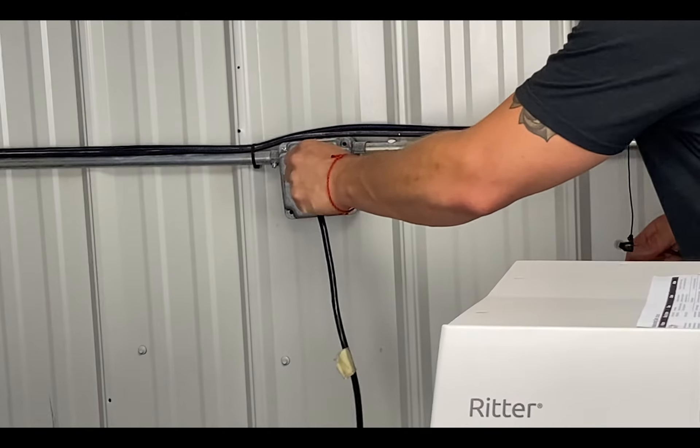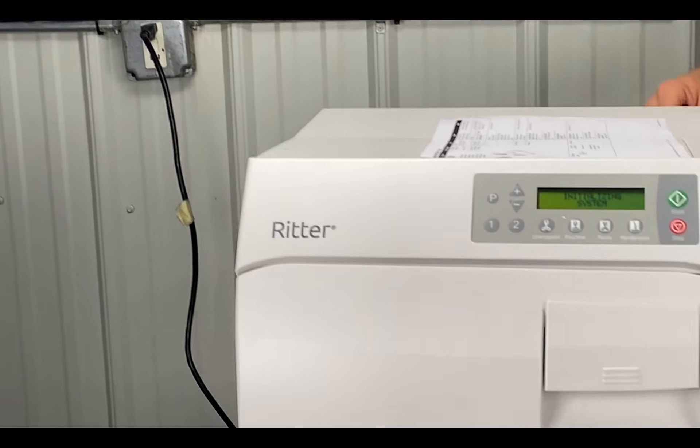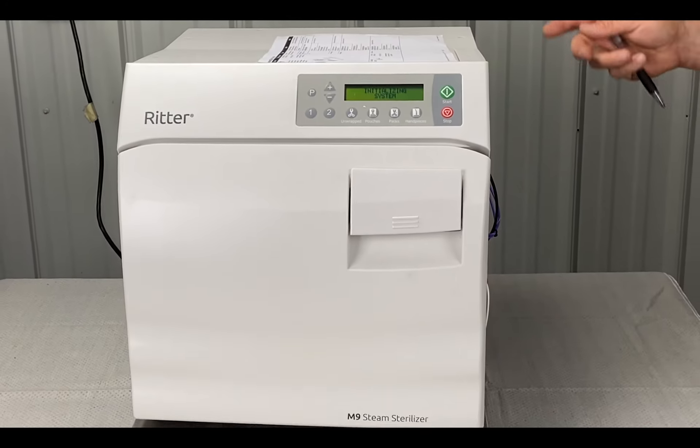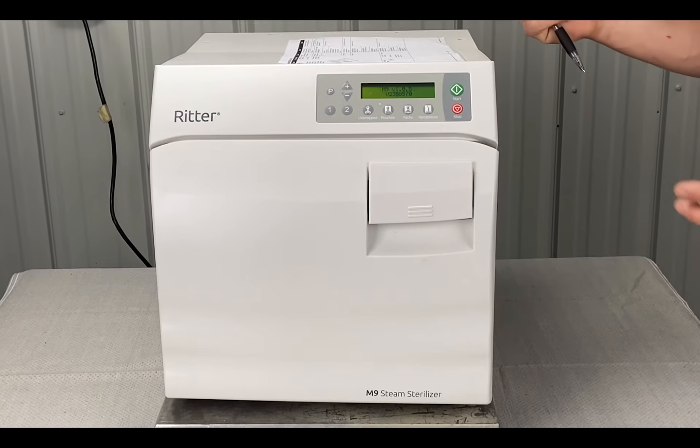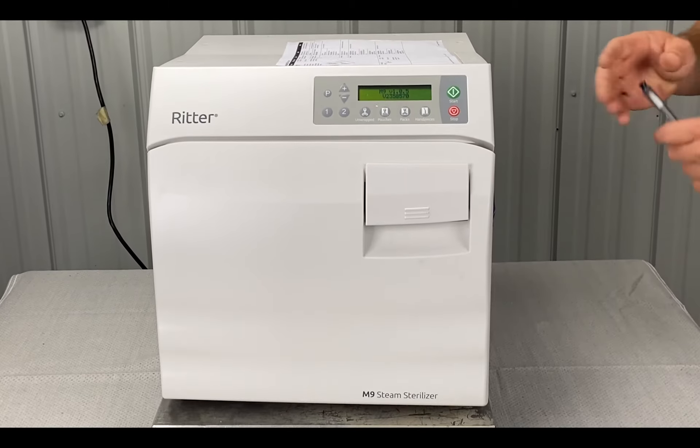Then you're going to plug it into the wall, and you'll wait 60 seconds after the error before plugging it in, and then see if the problem persists — run another cycle and see what happens.